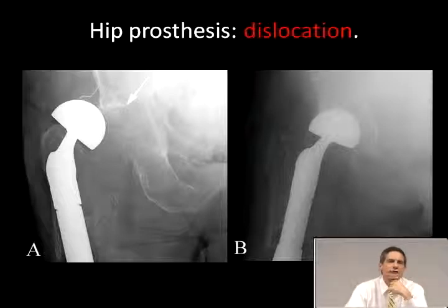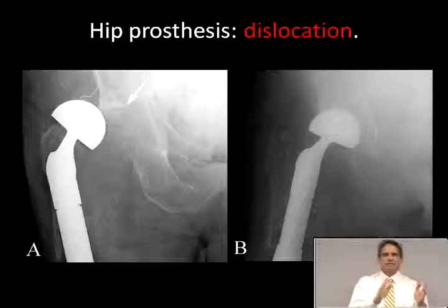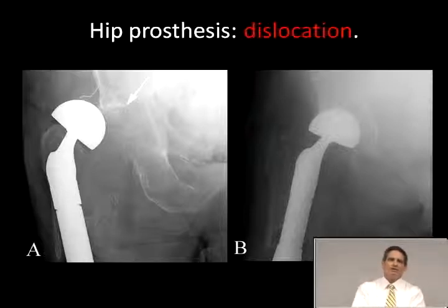Now, in general, you're going to see this more in the lower extremity than the upper extremity because of the frequency with which prostheses are performed. Basically, patients with prosthesis and after fracture fixation usually will undergo X-ray exam to look for dislocation and any hardware complication, and also dystrophic calcification. Usually those films are going to be ordered at 1 and 3 and 5 years, and then every 5 years by the operating orthopedic surgeon.